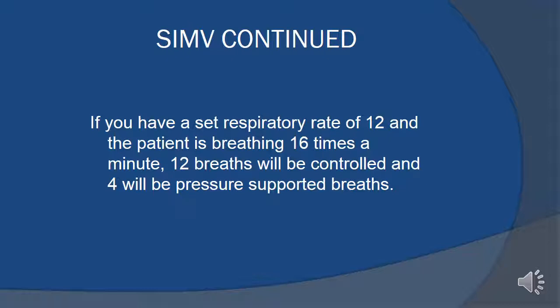So if it gives a breath right now, and it's waiting for 5 seconds to give the next one, and let's say at second number 3, the patient takes a breath, that machine's not going to give another breath 2 seconds later. That would be very uncomfortable for the patient. It basically resets itself at 5 seconds so that it can synchronize with the patient, thus making this a lot more comfortable for them.